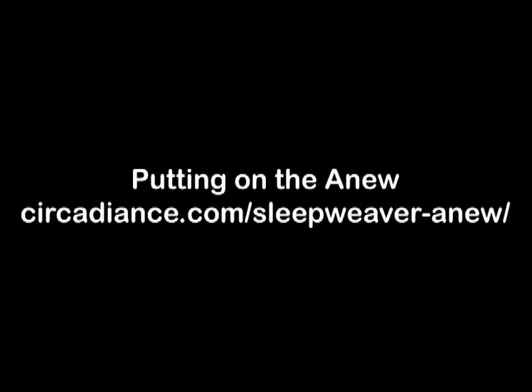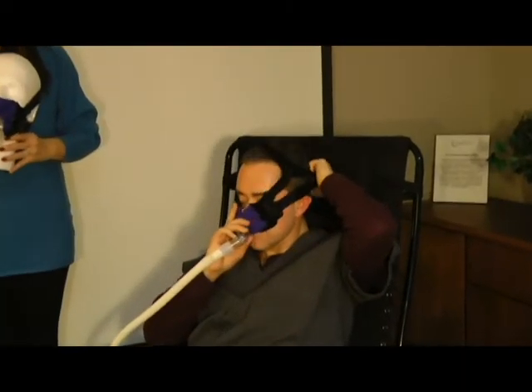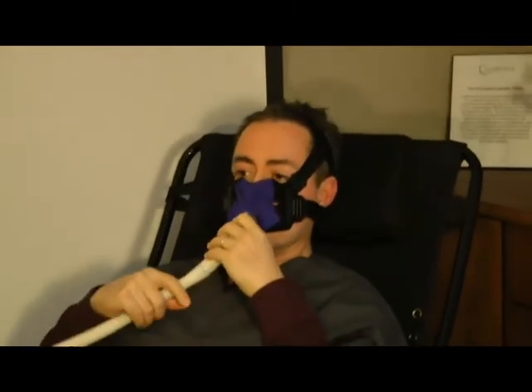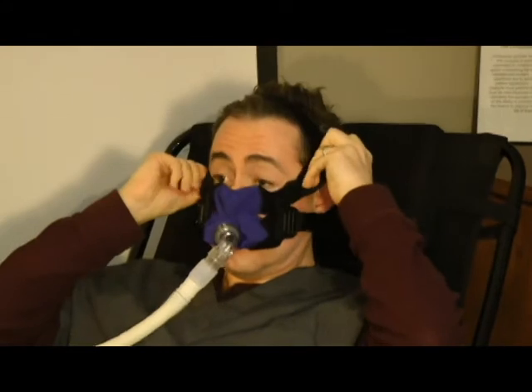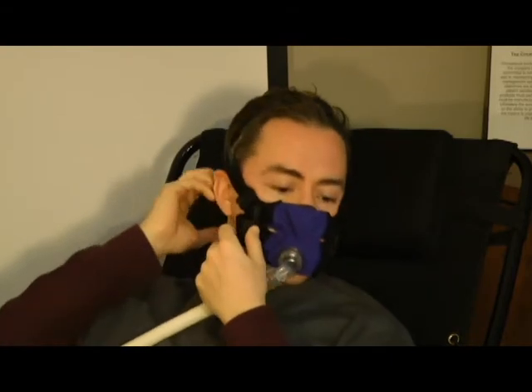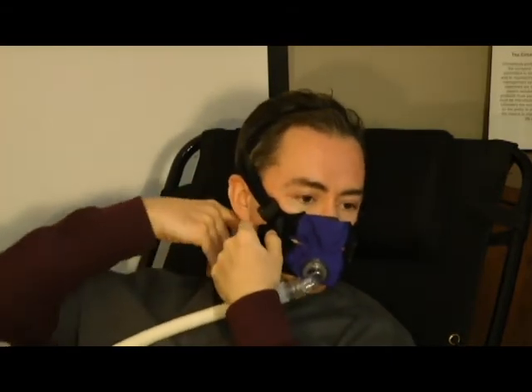Putting on the Anew. When attaching the Anew, it's best to practice in front of a mirror. Secure one of the quick-release tabs to one bottom strap before placing it over the head. Note that the bottom straps must rest directly along the bottom of the jaw below the earlobes. After placing over the head, now you can attach the second quick-release tab.